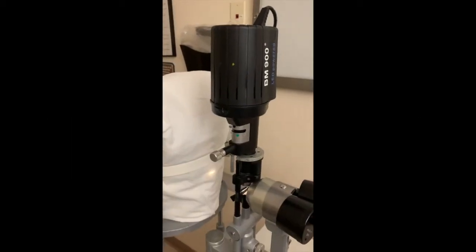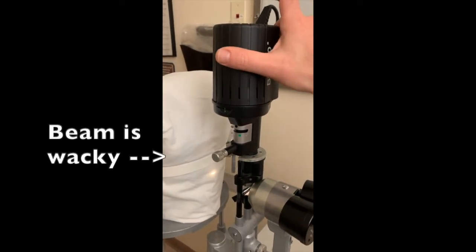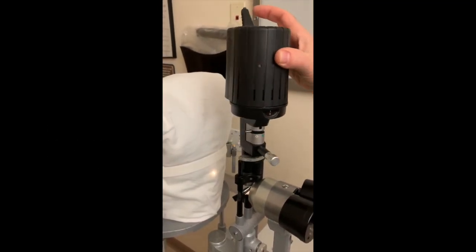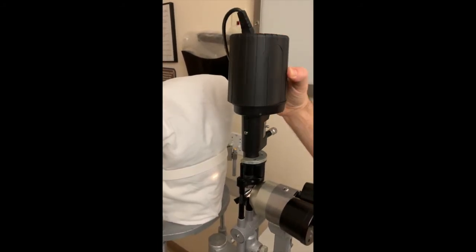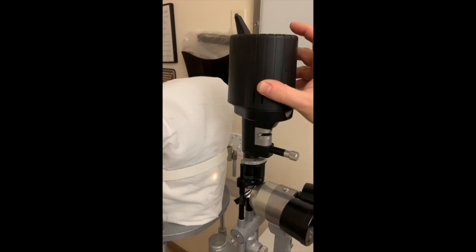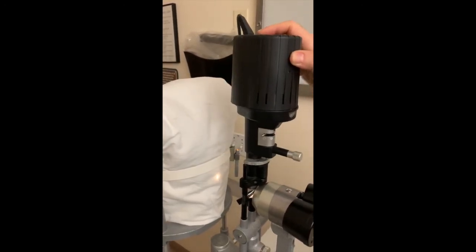So what happens if you walk in and find it like this? Well, it means that someone turned this part of it on the top, which gives you a horizontal beam. You'll probably never use that, but you may sit down and find a horizontal beam and not know what to do with that. And this is how you straighten that out again.